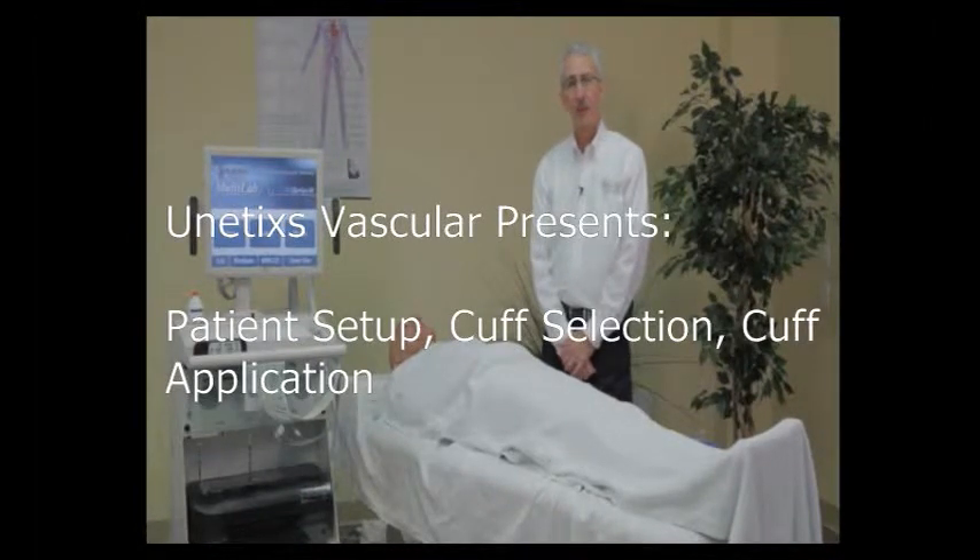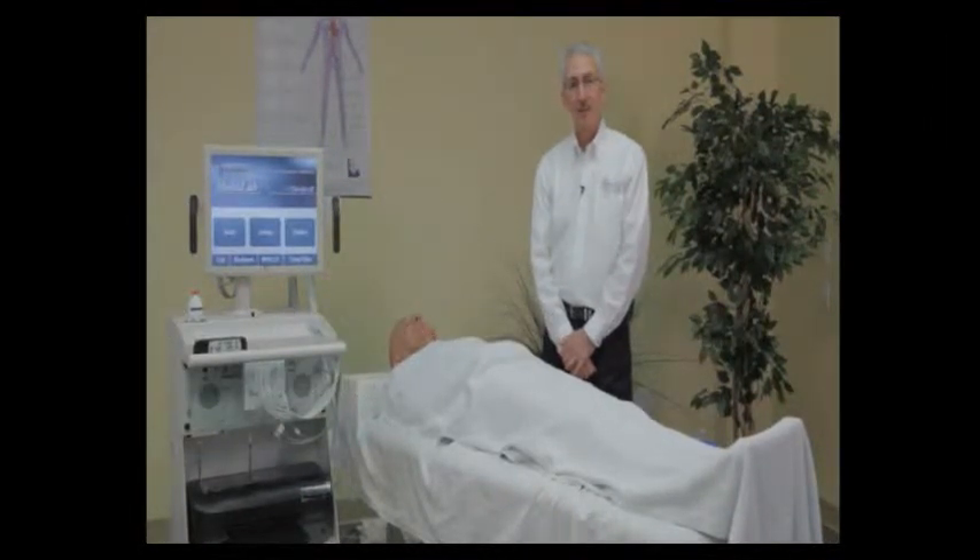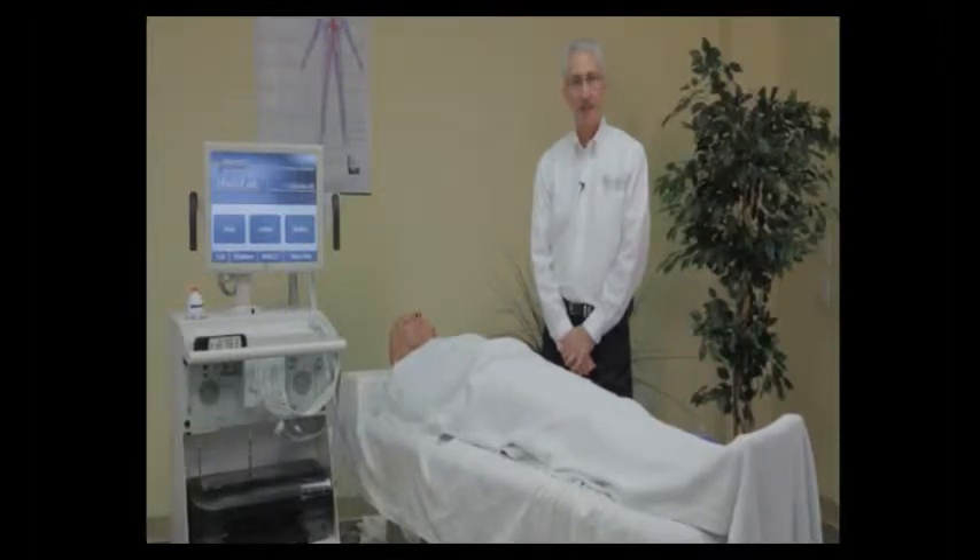In this portion of the video, we're going to talk about the basics: patient setup, cuff selection, and cuff application.